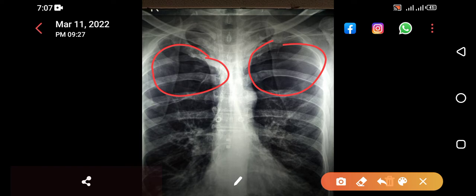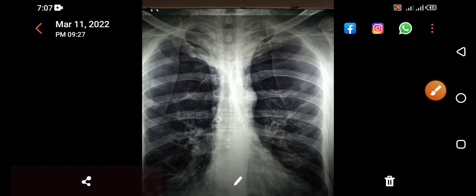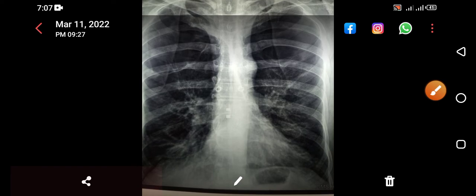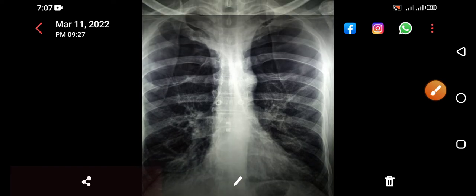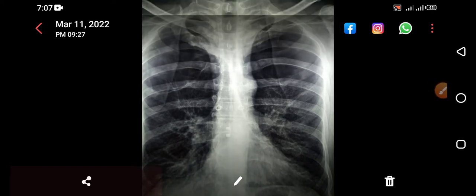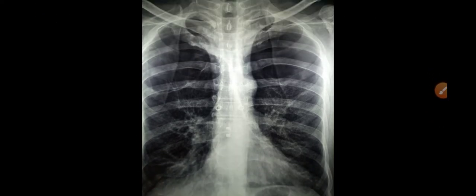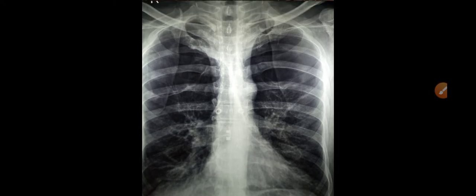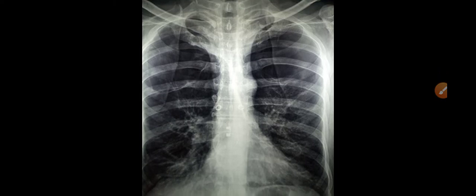This is actually a case of advanced COPD. In early COPD, the chest X-ray is usually normal. So the main pathology here is emphysematous changes. The diagnosis is a case of COPD with bilateral bullae.